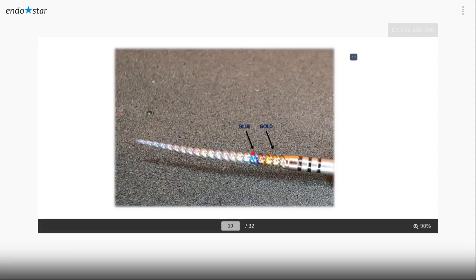To remember with me, most of the brands in the market have this color, some brands have this color, some like E3 Azura have the blue color. So in this picture, I made a different heat treatment all over the austenitic wire, and I didn't touch the file. And as you can see, you have a different phase transformation.